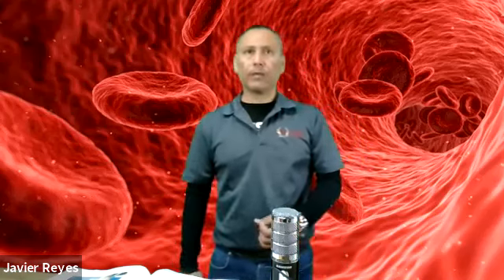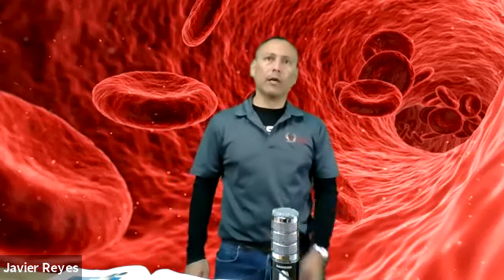So every time you're going to collect a capillary puncture, you have to keep in mind what test is going to be performed. And if it's one of these coagulation studies, blood cultures or ESRs, remember that is not going to happen. Now, there are some patients that will insist on you collecting a capillary puncture because they don't know and they think that every test can be done with a capillary sample. So you might have to do a little bit of explaining for them. But just keep that in mind. Don't bring specimens in a capillary tube that cannot be performed or processed that way.